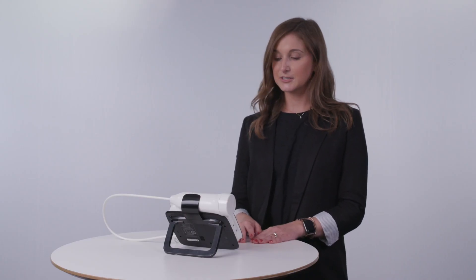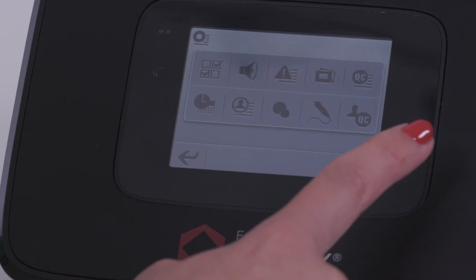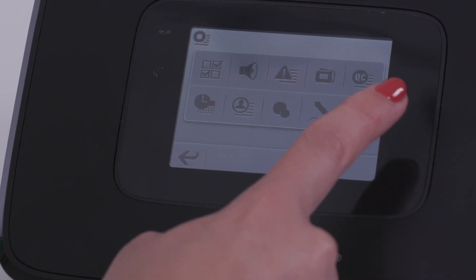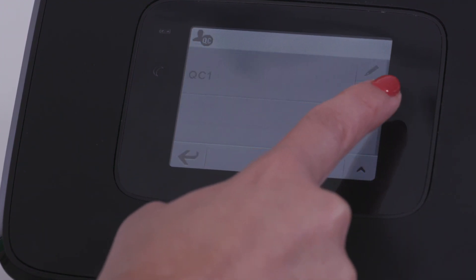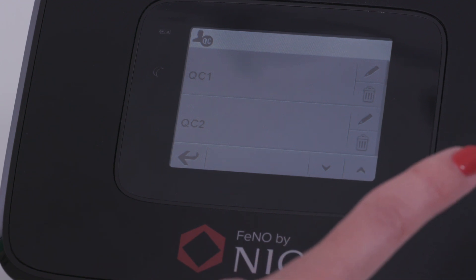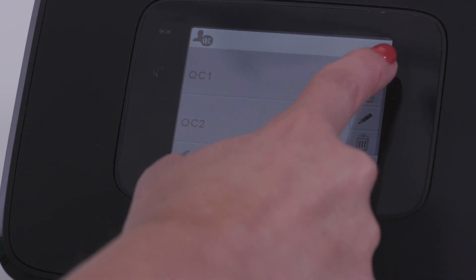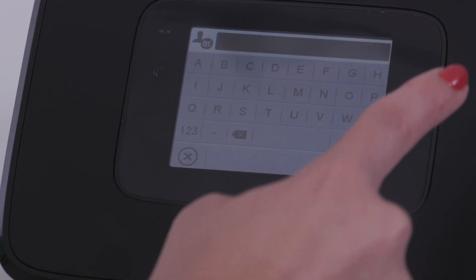The first step is to create a QC user. To do this, simply go to the settings icon on the home screen, select the QC user icon, and select the pencil icon in an empty user slot.